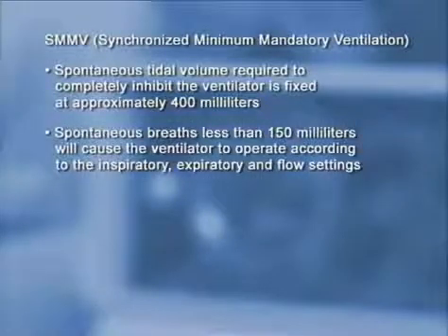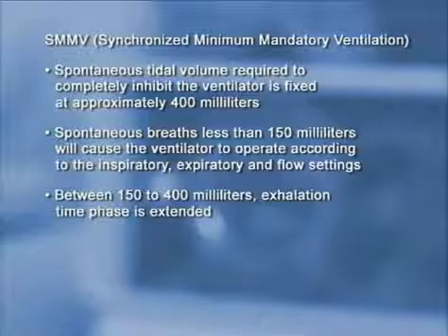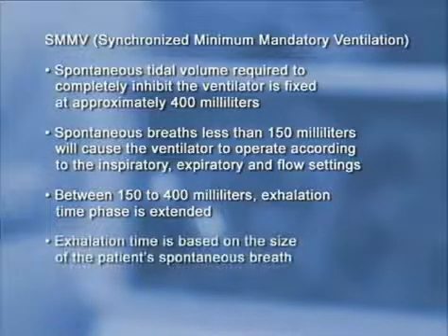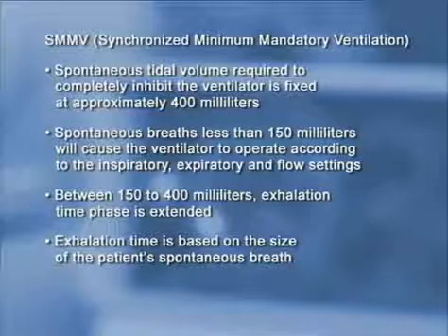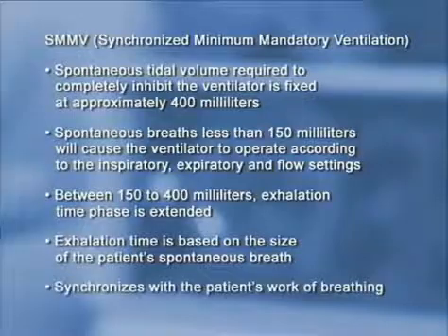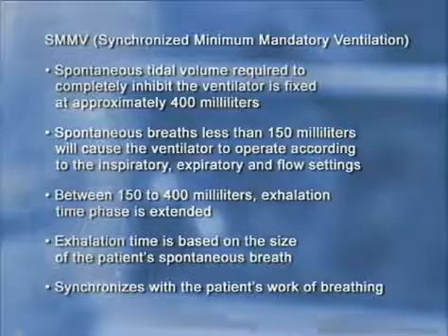Any spontaneous breaths less than 150 milliliters will cause the ventilator to operate according to the inspiratory, expiratory, and flow settings. In the range of 150 to 400 milliliters, the ventilator will extend its exhalation time phase so the patient can fully exhale. This exhalation time is based on the size of the patient's spontaneous breath. It will continue to synchronize with the patient's work of breathing to avoid stacking breaths.